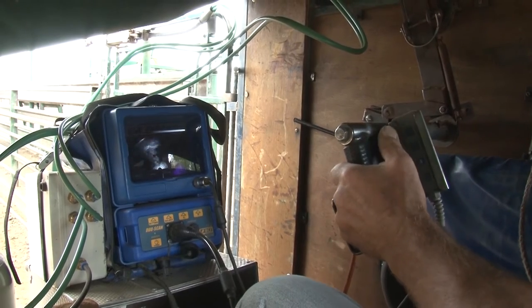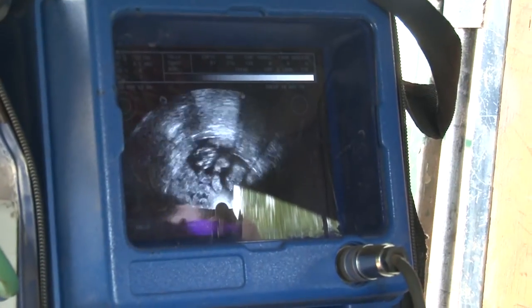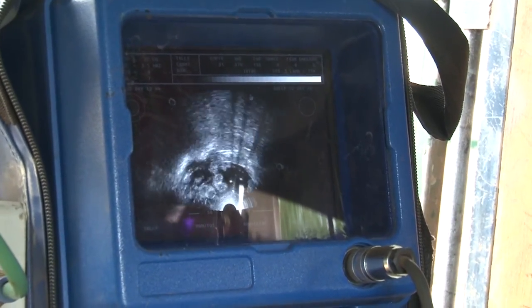Twins are out to the left and dryers are out to the right. This one here we've got a twin — nice twin there — two pockets of fluid. One in each pocket, left and right. Two bodies on the screen there now. She'll go out to the left.